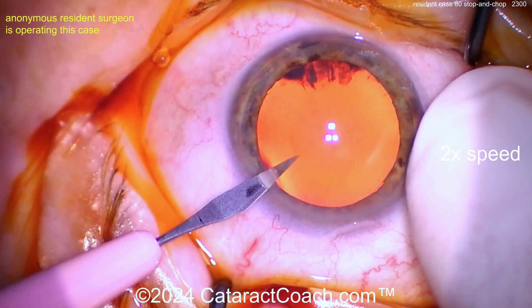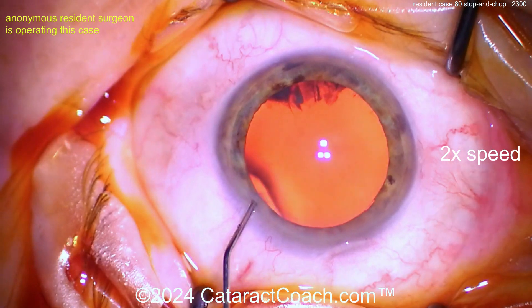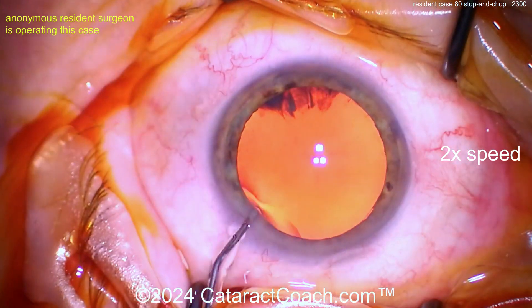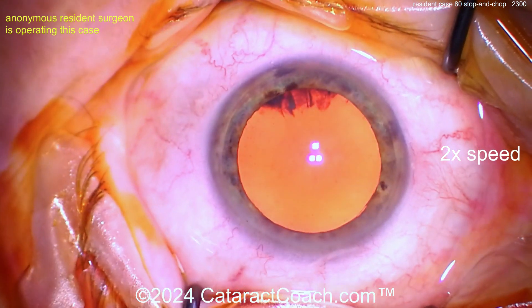Starting with the paracentesis there — that looks reasonable. There's the para. What are we going to put inside here? Maybe some anesthetic. Make sure you get past Descemet's, get that in there — probably some anesthetic.